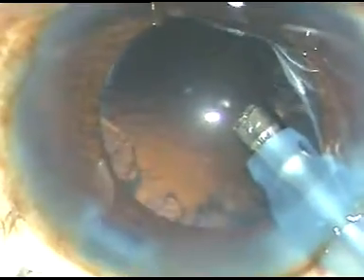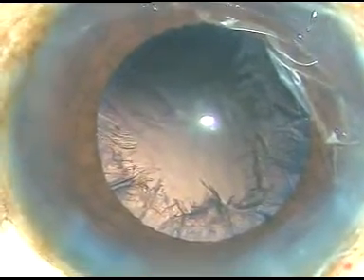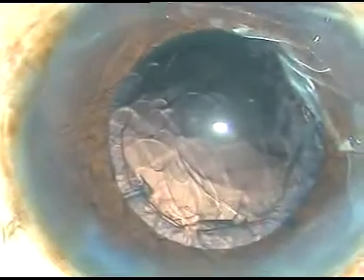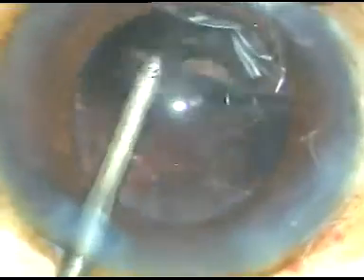Whatever little bit of nuclear pieces are there at the side port are removed and then I come out. Now I inject viscoelastic substance, and this is use of bimanual IA. The irrigation is through the right side port and aspiration is through the left side port.